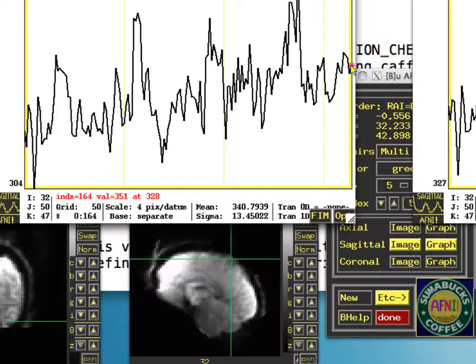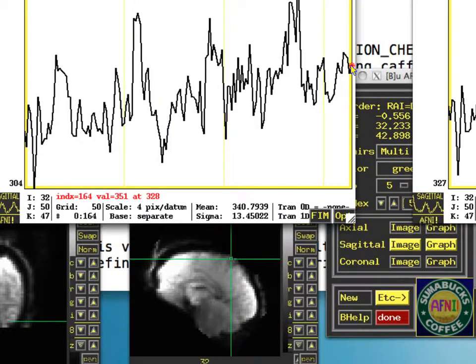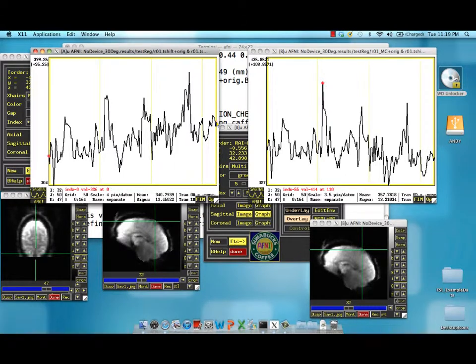There's a noticeable amount of motion going on here. That's not surprising because over the course of a four or five minute run, the subject will move a little bit.